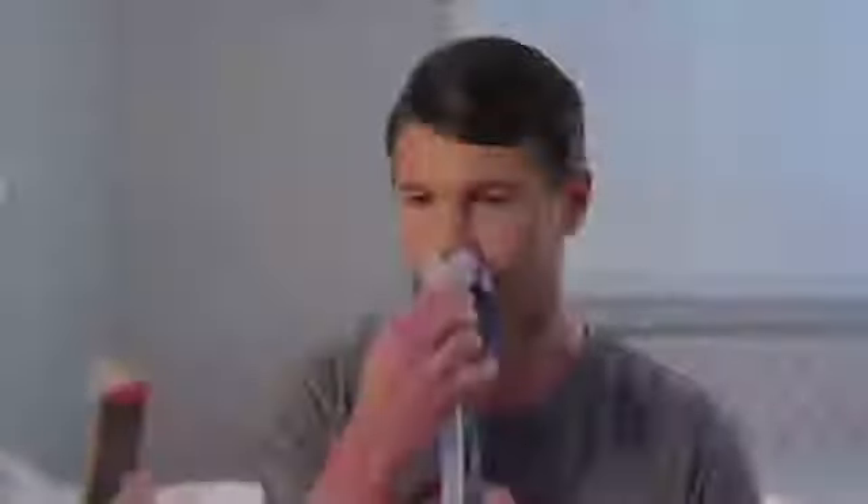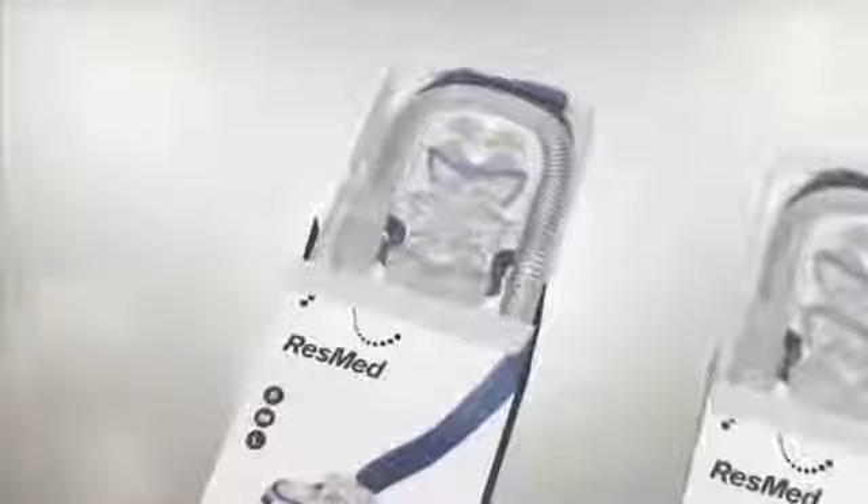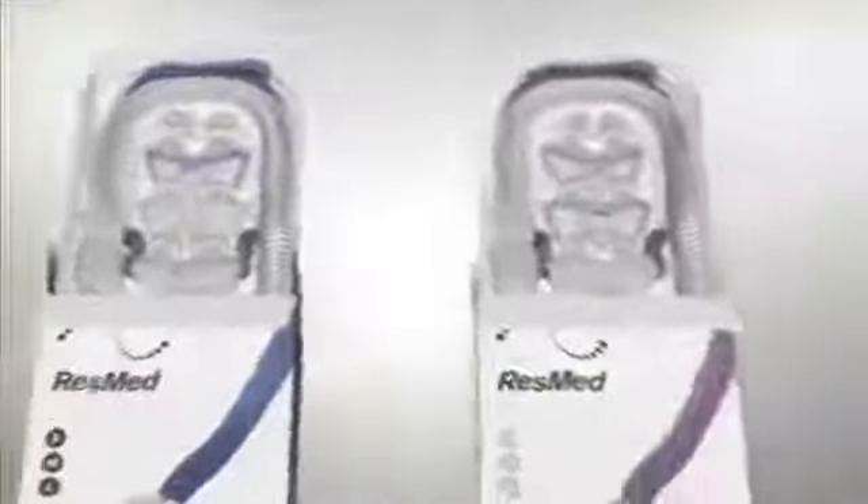Hold the mask close to your nose, then put the pillows in your nose. If the pillows in your AirFit P10 are not fitting well, they may not be the best size for you. Included in the pack are two others to try that may fit your nostrils better. If in doubt, consult your physician to review the sizing of your mask. Your home medical supplier can also provide valuable advice.